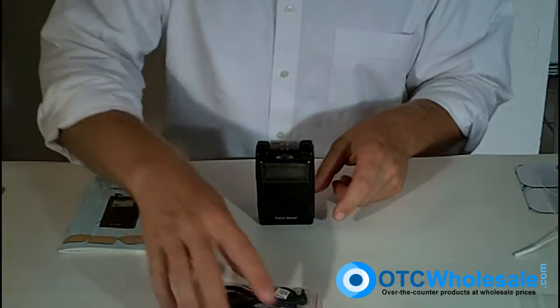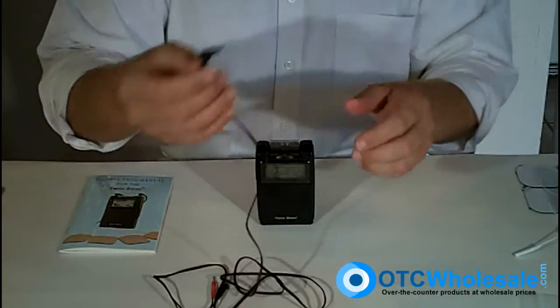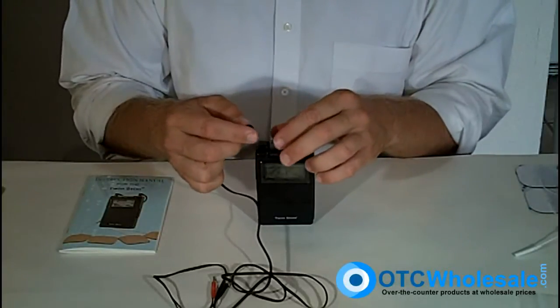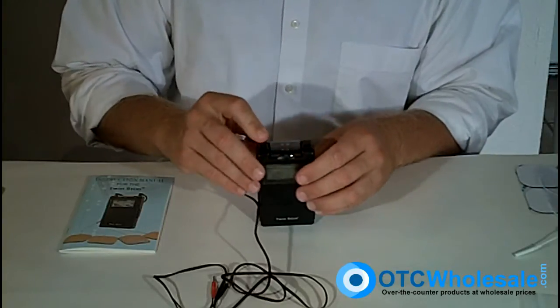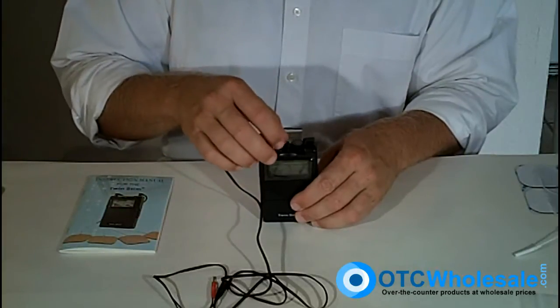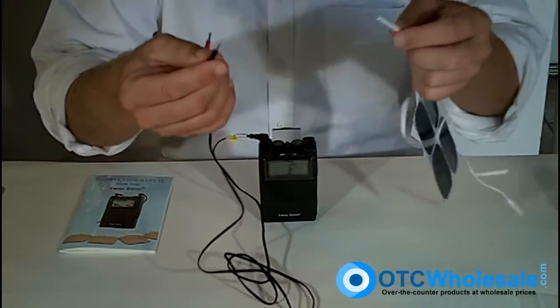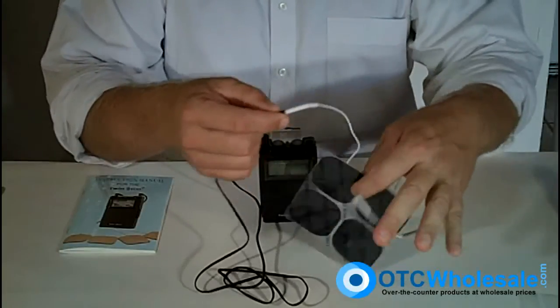The wires look like this — this is the same kind of wire that fits in the TENS 3000, 7000, Twin Stim, and 7500, which is a three-mode muscle stimulator unit. You simply put the eighth-inch pin into channel one like that and it's ready to go.